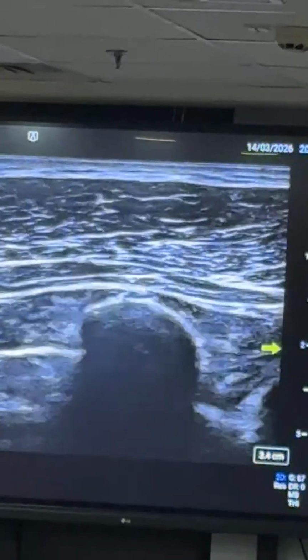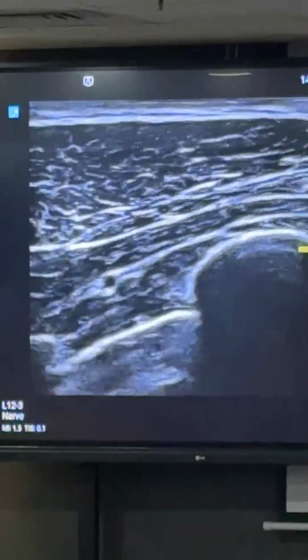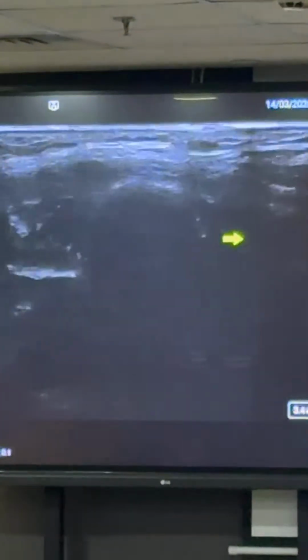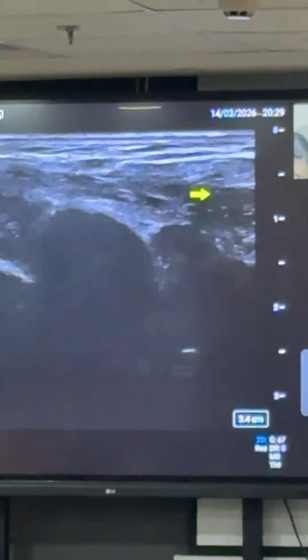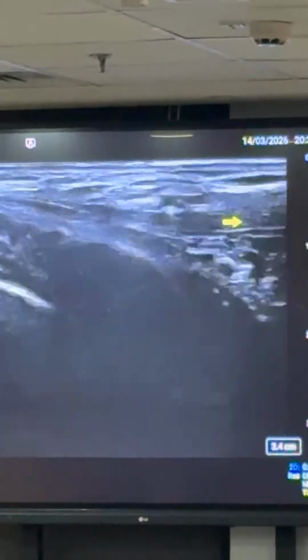If you follow the muscle towards the lateral chest wall, you can identify the muscles right there. I'm coming here. Okay, the same muscles. I can see the muscle just above the rib is nothing but the serratus. Once you come to the lateral wall of the thorax, it becomes more and more thick, and more posteriorly.